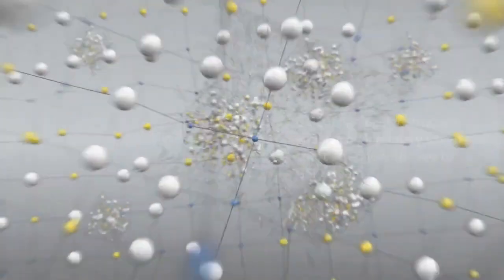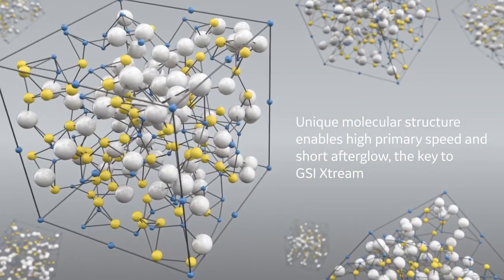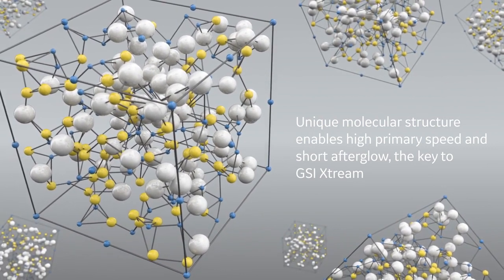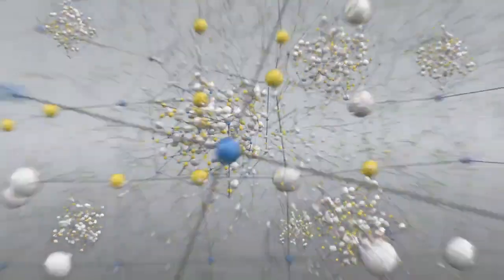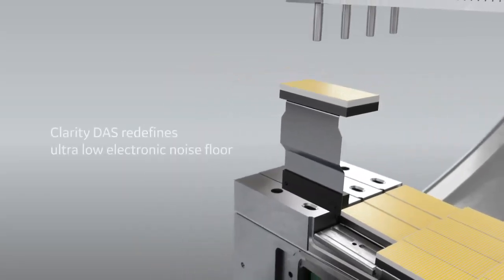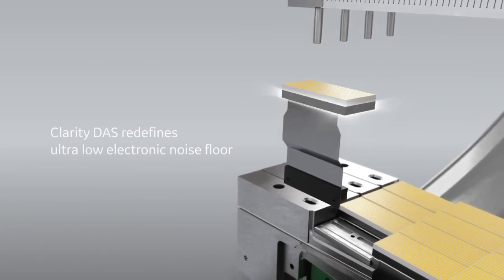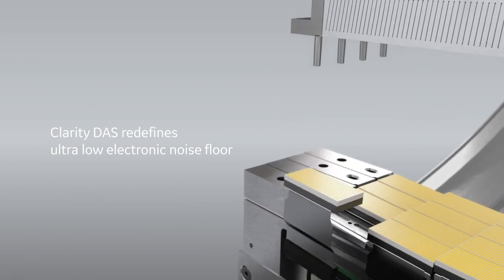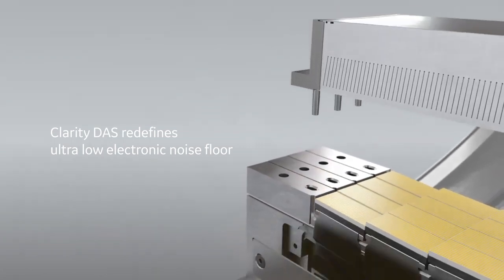Solid-state crystal detectors have been made from a variety of materials, including cadmium tungstate, bismuth germanate, cesium iodide, and ceramic rare earth compounds such as gadolinium or yttrium. Because these solids have high atomic numbers and high density in comparison to gases, solid-state detectors have higher absorption coefficients. They absorb nearly 100% of the photons that reach them.